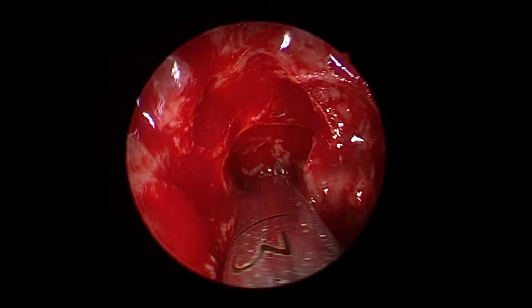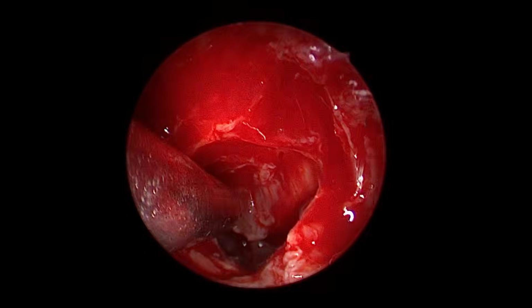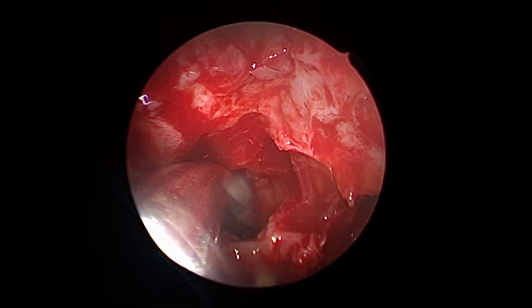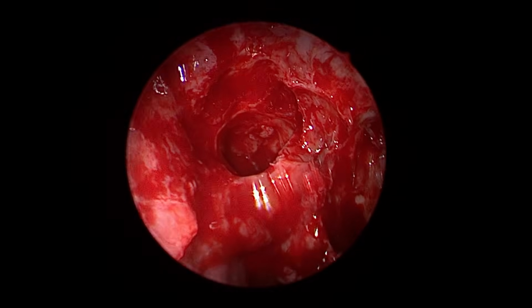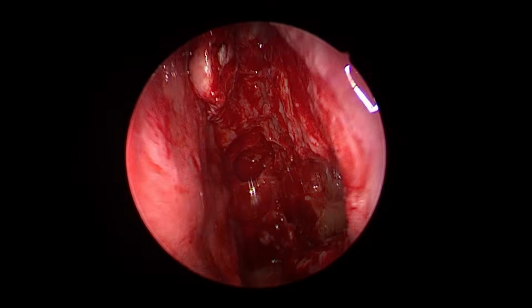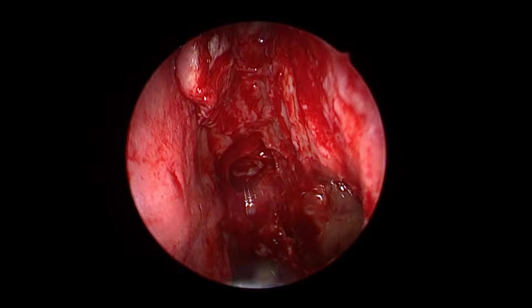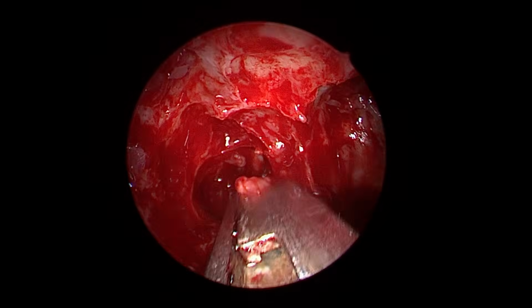see now, in the sphenoid with this inferiorly directed view, see this mucosal hypertrophy. Don't use any sharp instrument blindly in the sphenoid. See this? Yes, sir. That is the sphenoid. Give me the Carlson. See, adequate antrostomies to deliver adequate topicals. And with the care taken while widening inferiorly, you can elevate the mucosa and then widen. In case you have to widen it more, preserve the vessel.